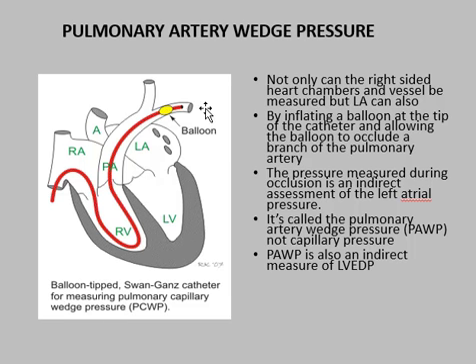You can record a very valuable assessment of the left ventricular EDP by accessing the right heart catheter, which is much easier, less traumatic, and less dangerous to do. This is called the pulmonary artery wedge pressure. And as I mentioned, the wedge pressure is also an indirect measure of the left ventricular EDP. In fact, if you measure them simultaneously in the left atrium and the left ventricle, the EDP and the LA pressures are identical. You superimpose them perfectly.